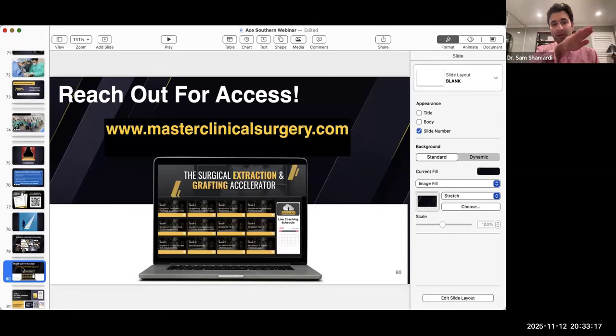So in that area, I will do that same type of sectioning and I will put all of that force towards that middle section that's there. And I'm going to be getting essentially two small pieces out doing it that way. Because again, if it is severely decayed like that, my ability to have something to grab onto is simply not going to be possible. So that's what I'm doing with those single rooted teeth.